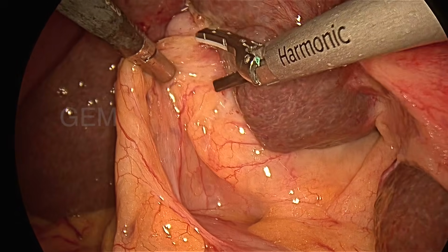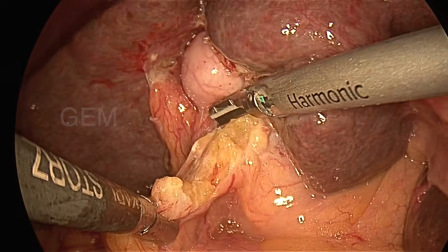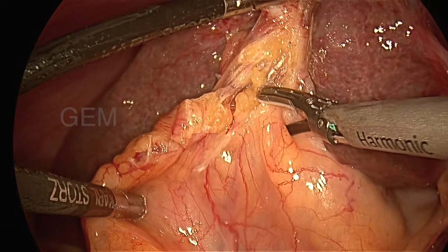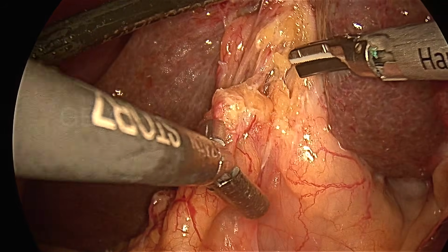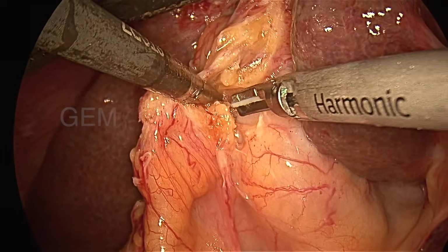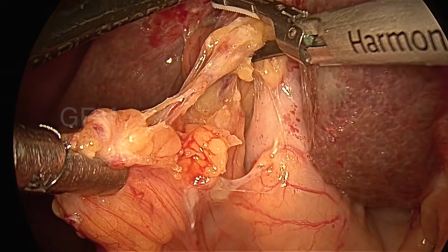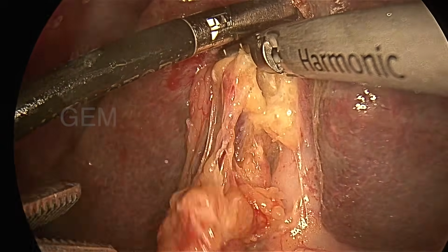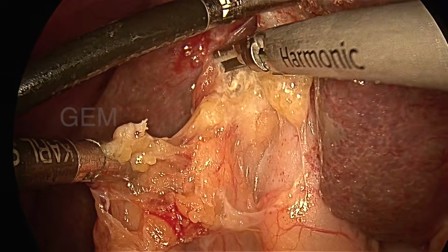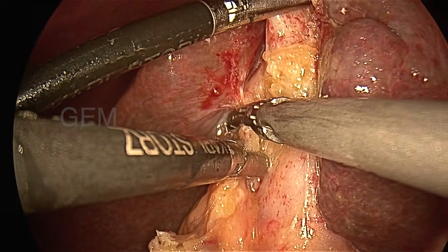So that is an omental adhesion. I'm using ultrasonic forceps for separating the omental adhesions. I hold the fundus of the gallbladder. See, I'm seeing the gallbladder wall now. So the omentum is very thick. I'm releasing all the omentum, and you can see by appearance itself, it is a chronic case, treated for a long time, and it has become contracted and chronic.